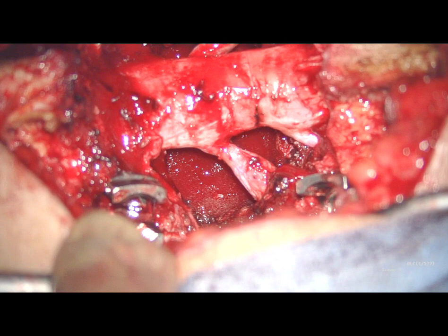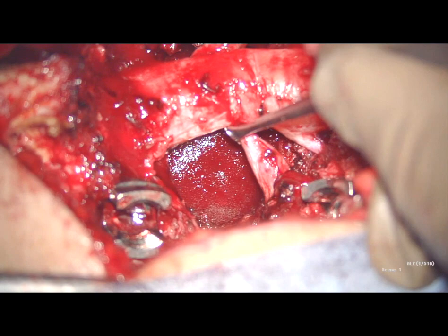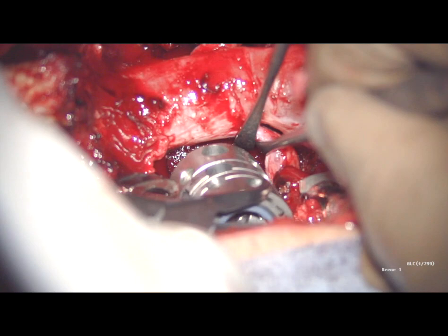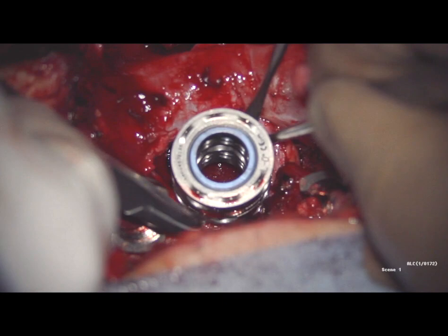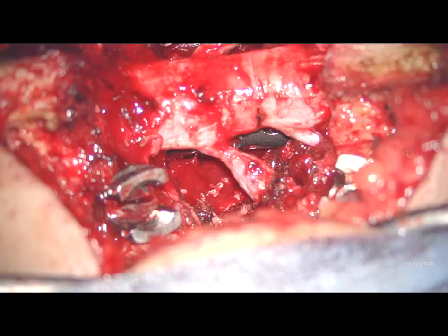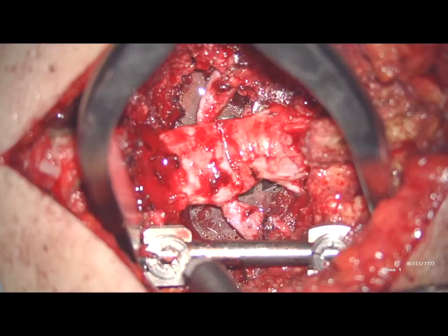After the corpectomy is finished, an expandable titanium cage is placed. Finally, the rods of the transpedicular screws are inserted and the screw nuts are tightened under compression.